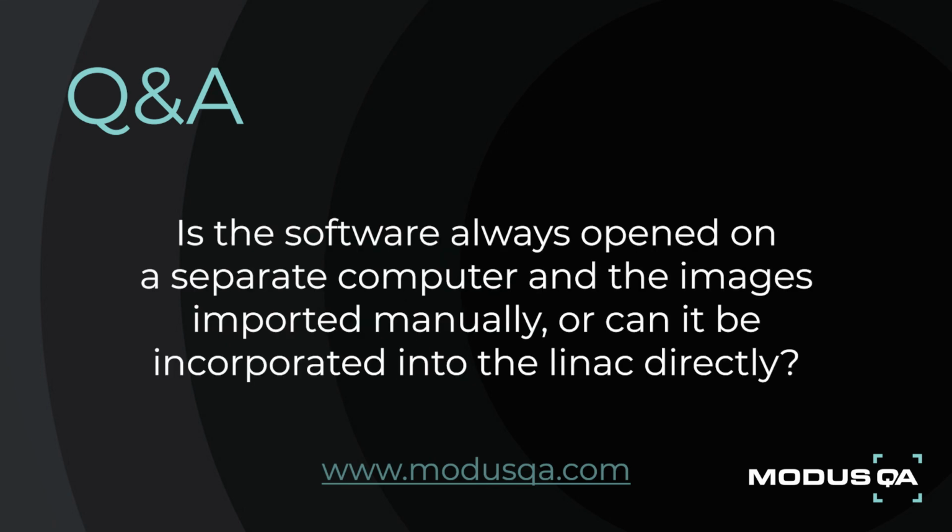Okay, is the software always opened on a separate computer and the image is imported manually, or can it be incorporated into the linac directly? We haven't incorporated it yet. There are things in the works where we're trying to get it incorporated into certain OEM equipment. But as it stands right now, you would have this open on a separate system, separate computer, and you would import the DICOM files into the software. Or if you have a way to push all your information to a PACS server, you can communicate with that PACS server to pull that data into the software.